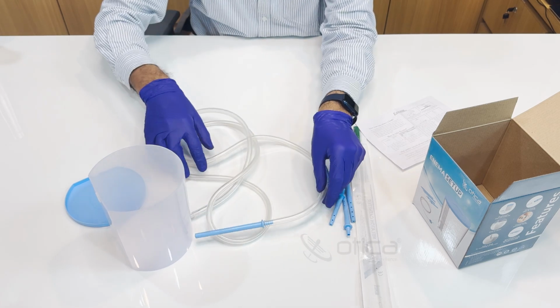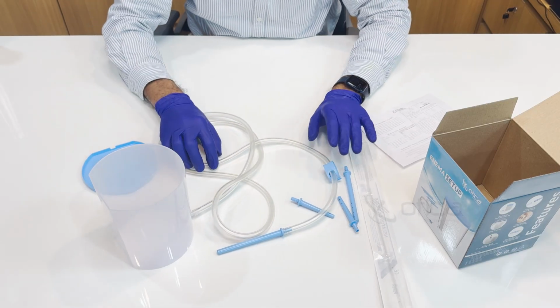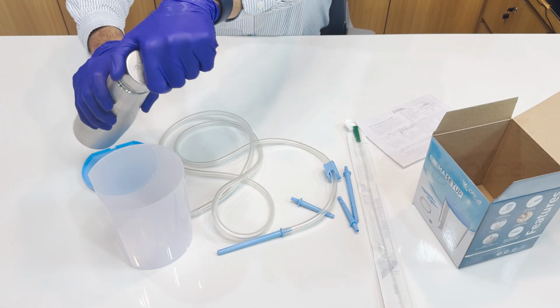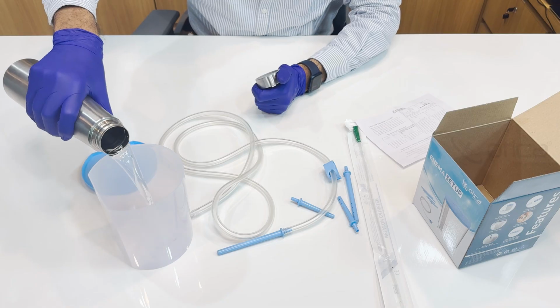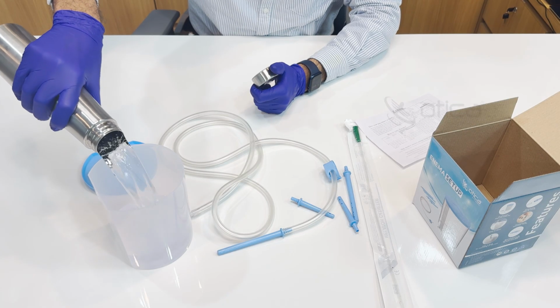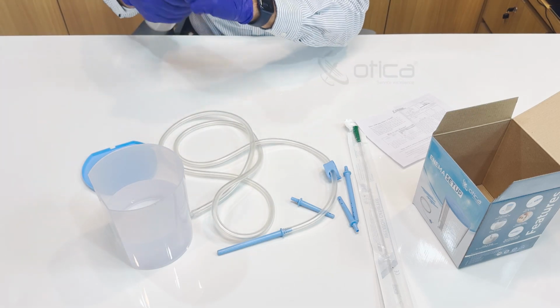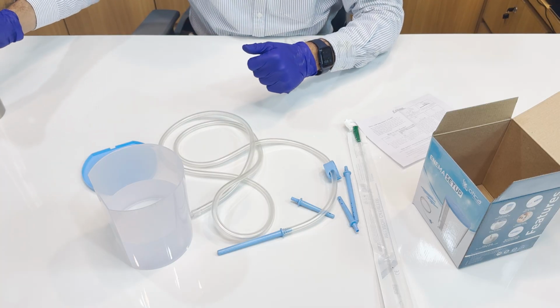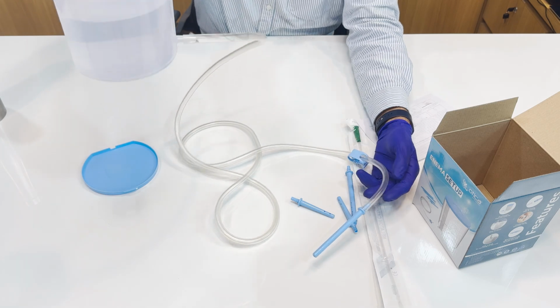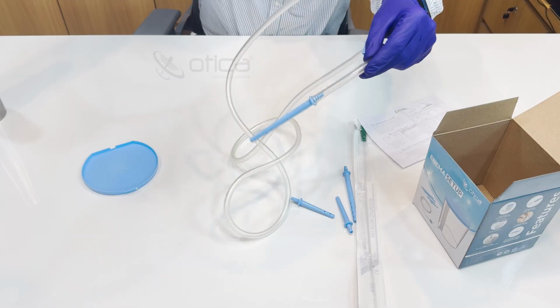Now the device is ready to use, and we can start by pouring water into the enema bowl for the setup purpose. You can see I have almost filled the container with 500 ml of water. You can see there is no leakage. I am increasing the height of the bowl. You can see there is no leakage.